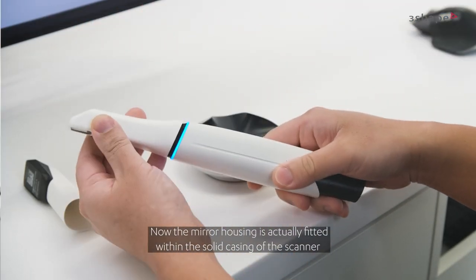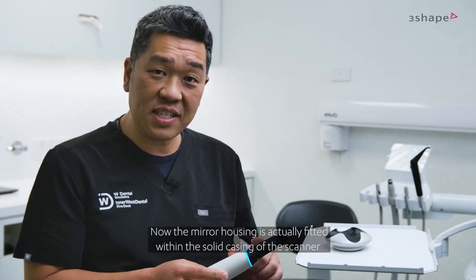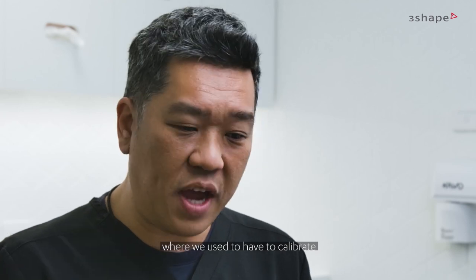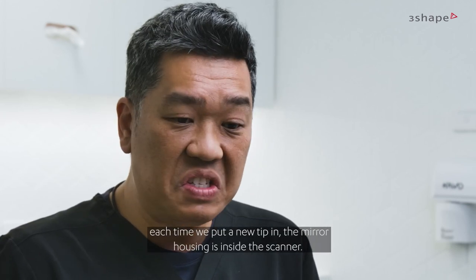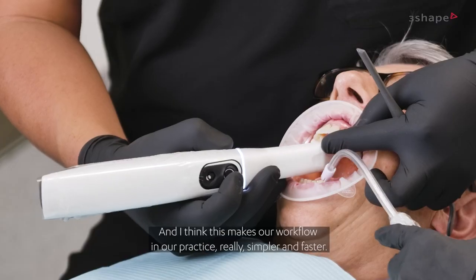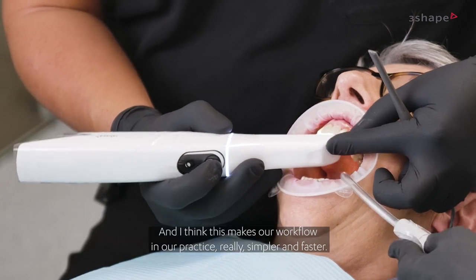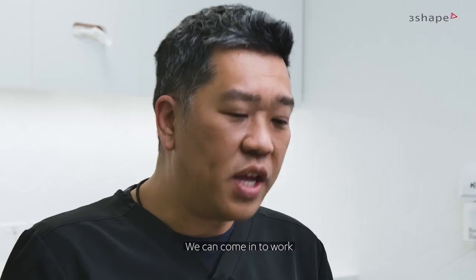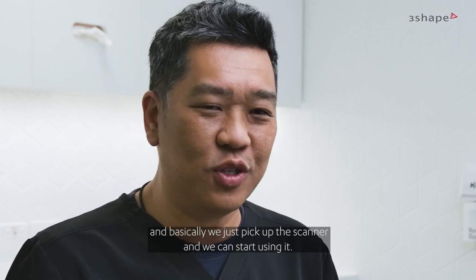One of my favorite features of the new Trios 5 is that we no longer need to calibrate. The mirror housing is actually fitted within the solid casing of the scanner. Where we used to have to calibrate each time we put a new tip in, the mirror housing is now inside the scanner so it's always constantly calibrated. This makes our workflow in practice really simpler and faster.